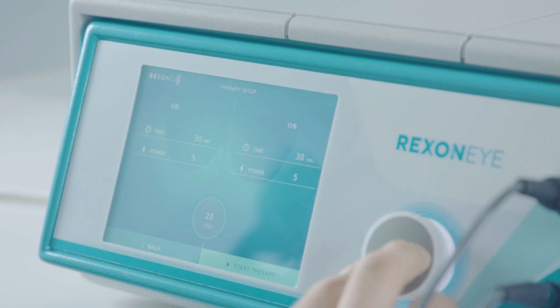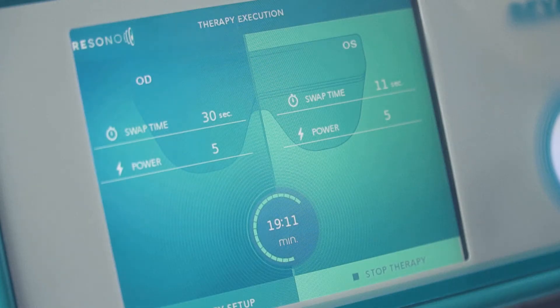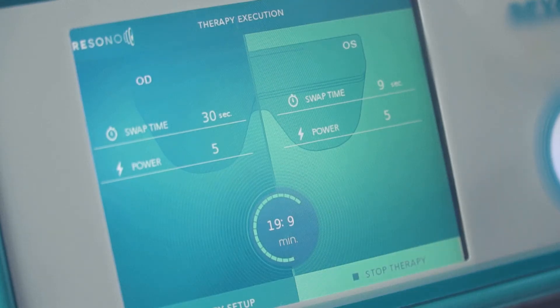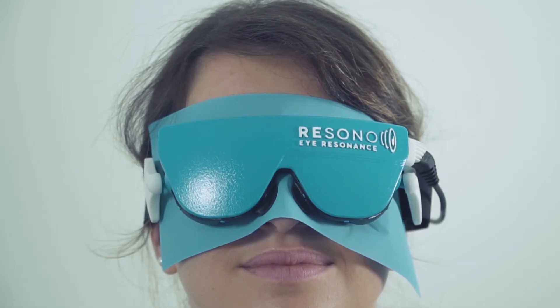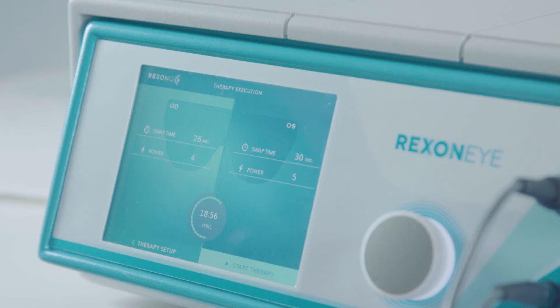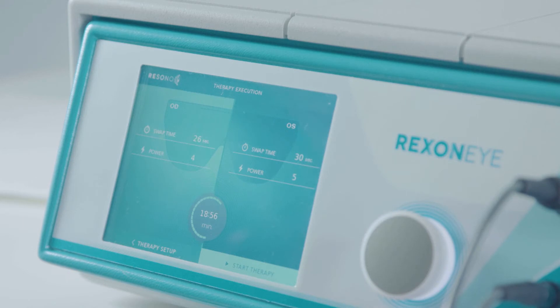Press Start to start the therapy. If the patient perceives a different heat intensity between the two eyes, pause the treatment by pressing Stop Therapy and reposition the mask accurately. Then restart the therapy by pressing Start Therapy. The patient might have different sensitivity to heat, which is considered normal and has no influence on the treatment outcome. Therefore, you can set a different power value for each eye to have the same heat sensation and to allow better uniformity in the delivery of the therapy.